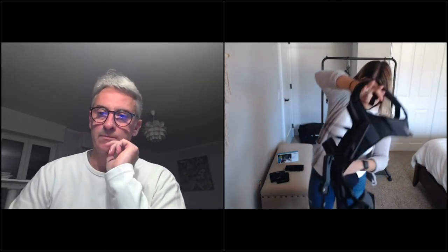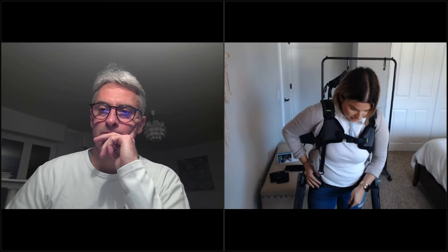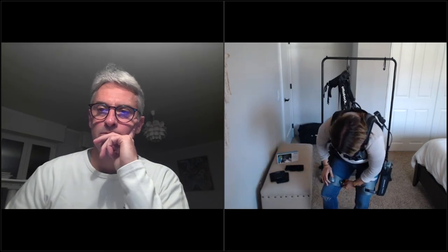And same thing, it's going to be much like a backpack. Four areas of entry as well, chest, the hip. Same thing with this system as well. You want to make sure it's anchored low and tight on the hips as it's the anchor of the system. And then each leg cuff, you'll put green to green. We have color-coded indicators of what goes where. And now I am in the device. This is used a lot with any bending, with lifting.